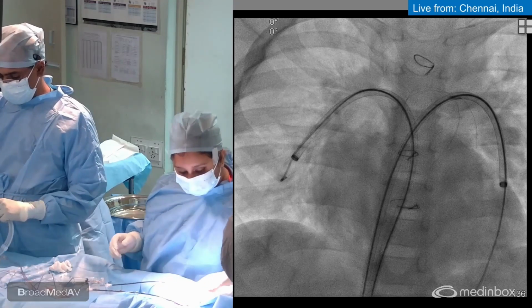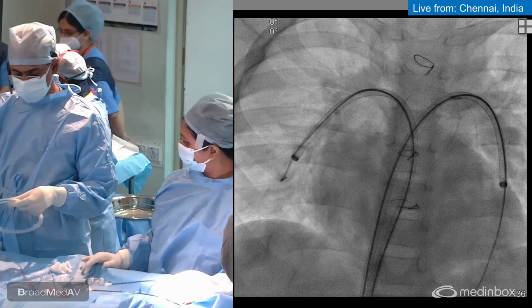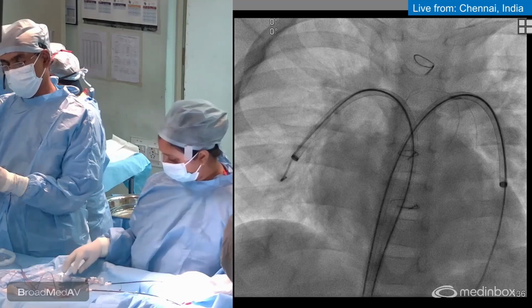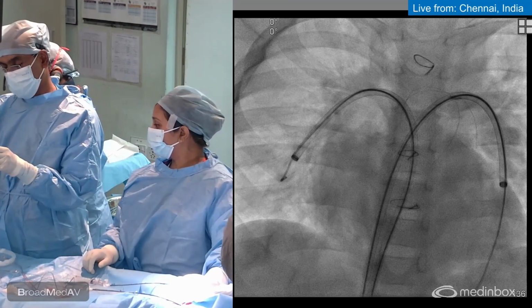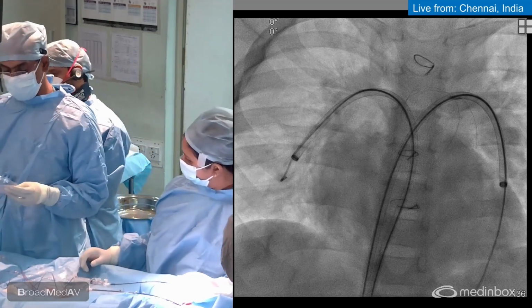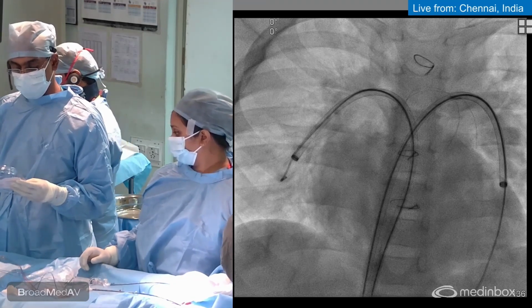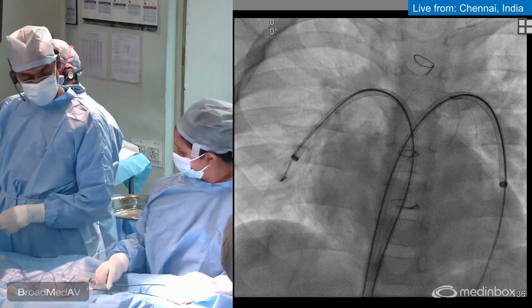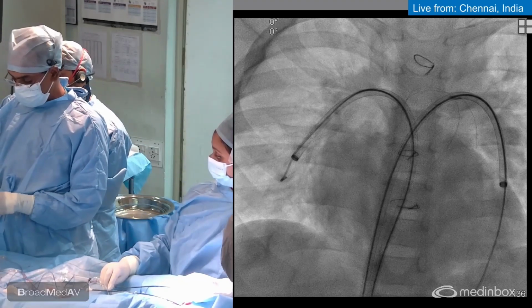The stent comes with its own balloon. There is a protective sleeve for the stent. So this is the protective sleeve. So this is the actual stent. So it's a 3 centimeter, right? 10 into 3, no? And the chart says that if I inflate it up to 10 atmospheres, it goes to a diameter of around 10.5 millimeters. So we are taking the right pulmonary artery stent now.